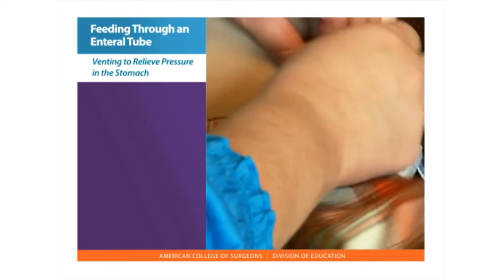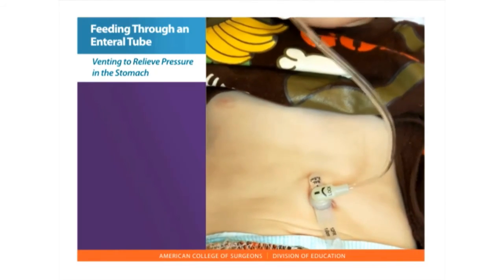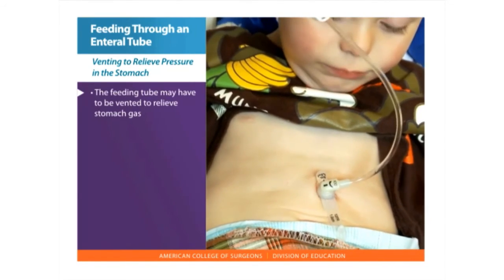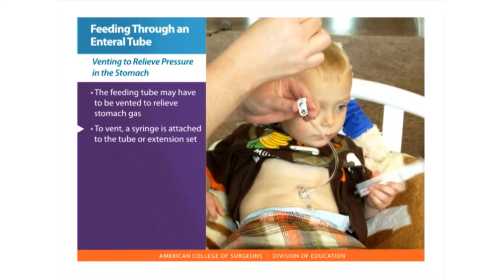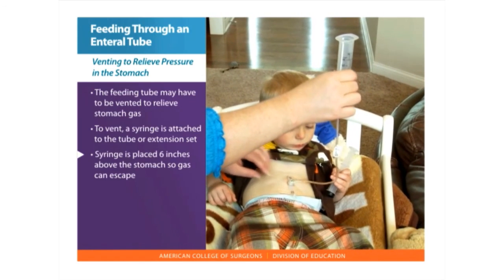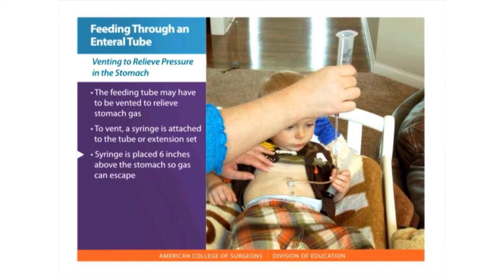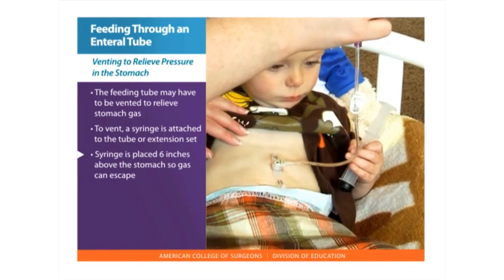Venting or burping to relieve pressure in the stomach. If you or a family member feels bloated before, during, or after feeding, the feeding tube may have to be vented to relieve the stomach gas. To vent, a syringe is attached to the tube or extension set. The syringe is placed about six inches above the stomach so gas can escape. The stomach contents can also pass up and down the syringe but won't spill over.